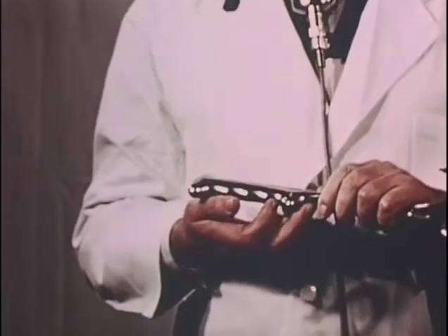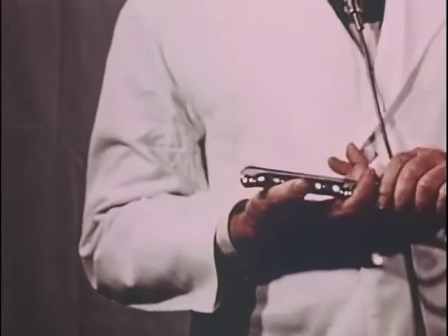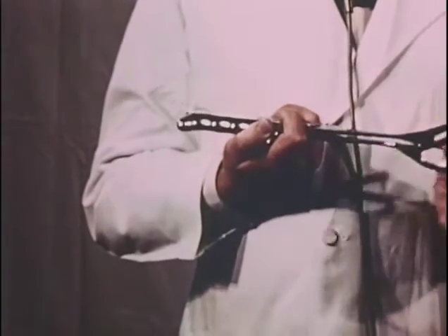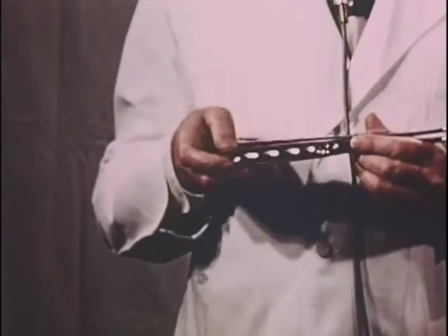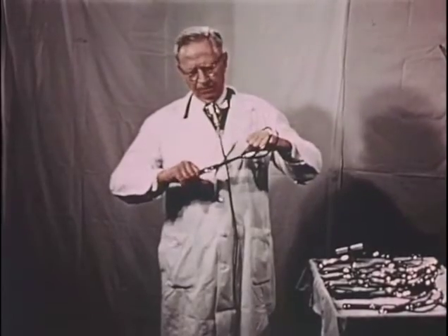And if one follows the principle of the third-degree lever, applies traction from the finger guards, there'd be avoidance of compression of the handles, which might give force transmitted to the fetal head and causing injury.